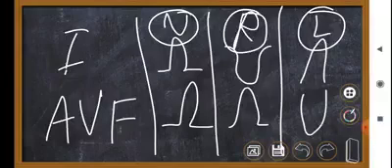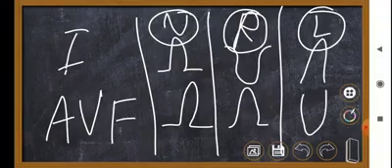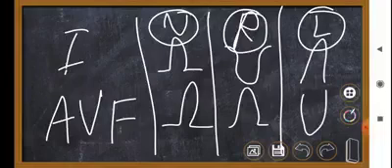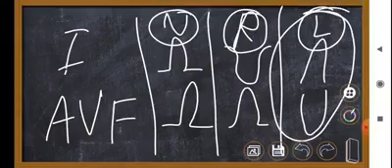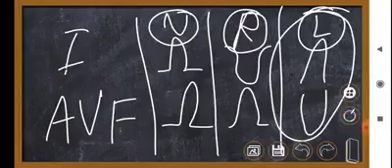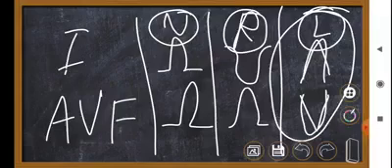Now I tell you a mnemonic, and that's my own mnemonic, and it has got nothing to do with the mechanism of formation of axis. If we focus at left axis deviation, or here, we see that these two QRS complexes, like the QRS complex in lead 1 is upward and in AVF it's downwards, so it seems like they are leaving each other, so they have left, so it's left axis deviation, just to remember.